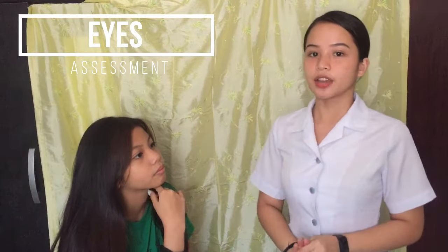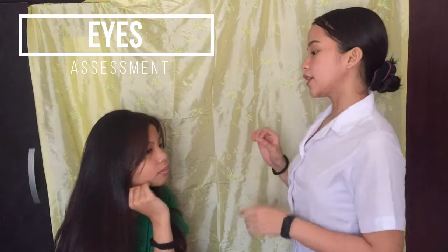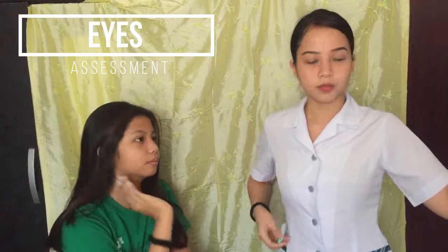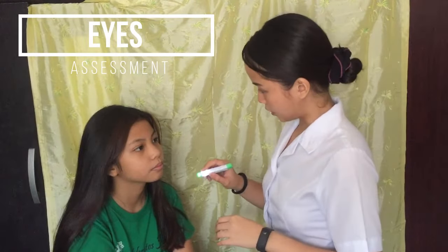So now we're gonna check for the accommodation of the pupils. So ma'am, I'm gonna shine a light on your eye again, okay? So I want you to look at that object again. Just look straight ahead. So I'm gonna start, okay?